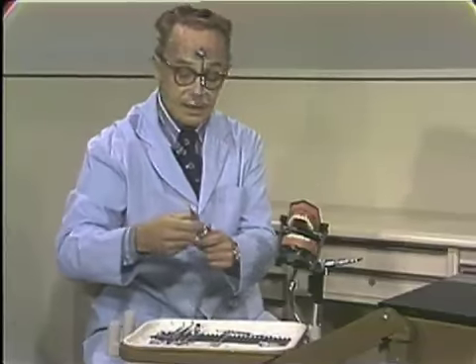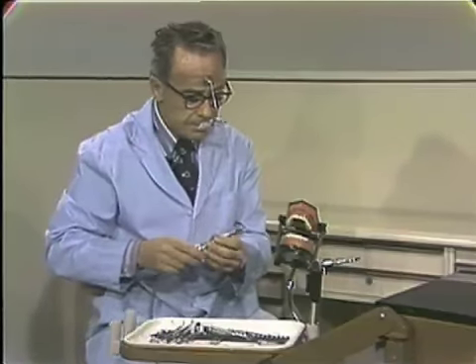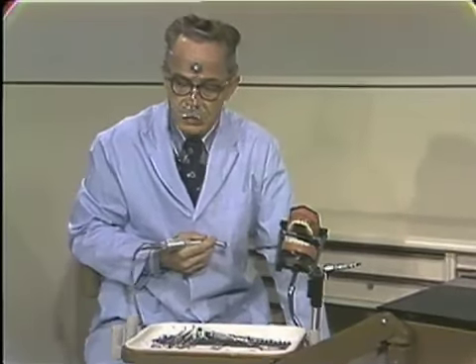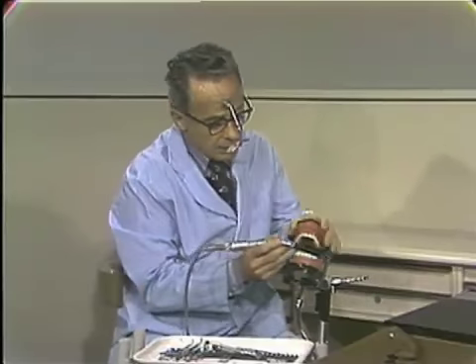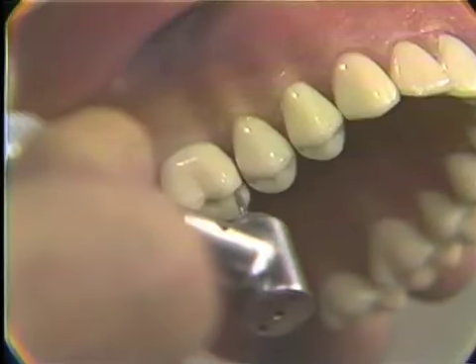I would like to just point out a little principle here on the conservative part of the slice preparation. This is one of the things that I've mentioned previously, that a slice preparation is very conservative for the tooth. I have on here a 669 fine diamond instrument, which many people use to bring their proximal walls out into immunity. Now, as we can see, we have taken the disc in and out of this situation without it binding at all. Now, I would like, with a tight shot here, please, to show the diamond in the cavity preparation.